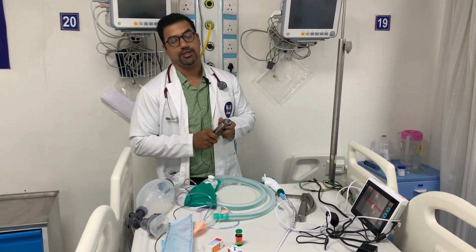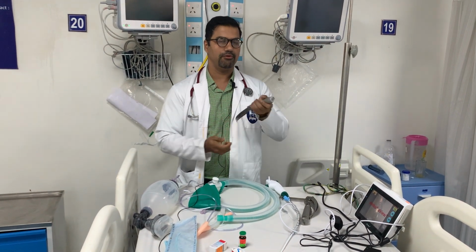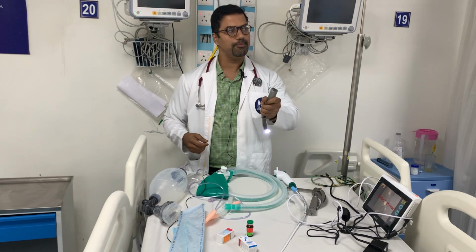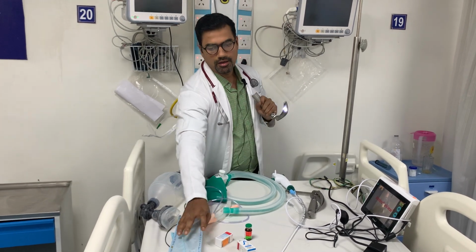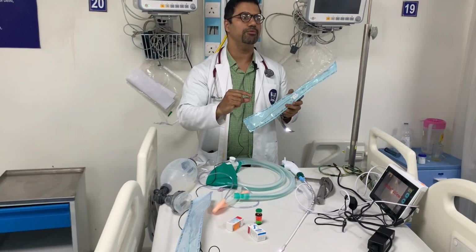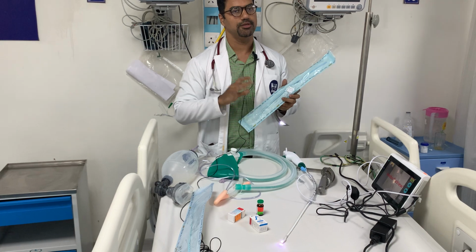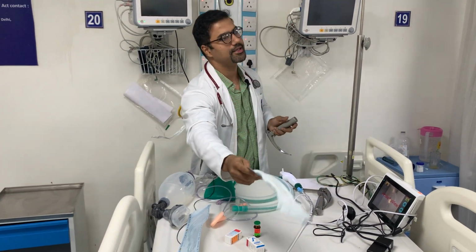Okay. Now supposedly, this class is specifically for ICU things. Supposedly, we have tried this and the patient could not be intubated. We have tried with the stylet. We have inserted this stylet in the endotracheal tube, and then we have tried to insert the endotracheal tube, but still the patient could not be intubated. Okay? We have lost one accessory.